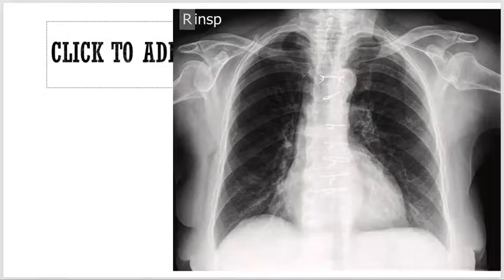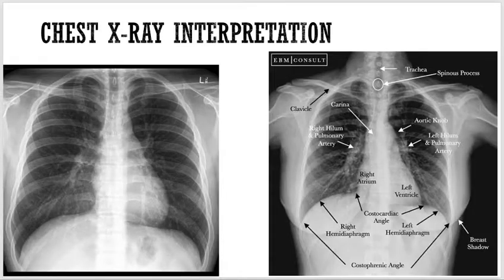For example, this is a person who is really obese. You can see his skin folds can be completely appreciated, and it looks like an X-ray of a female. This is a young female. Of course, her breast contour is very clear.